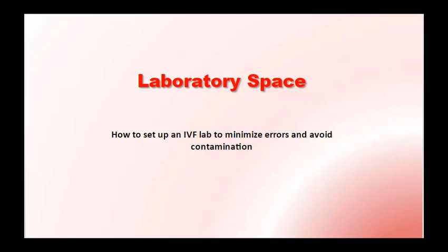Allocating sufficient space for different procedures in an IVF lab is also critical to minimize errors. Although many labs are constrained by the physical space they occupy, it is important to arrange the space in such a way as to create a safe yet efficient flow of work.